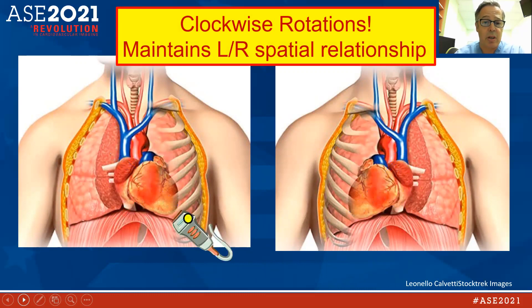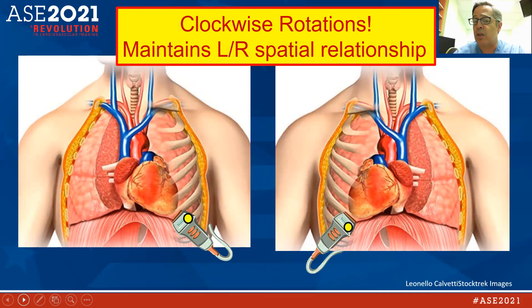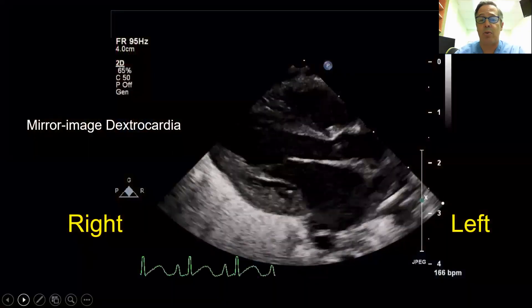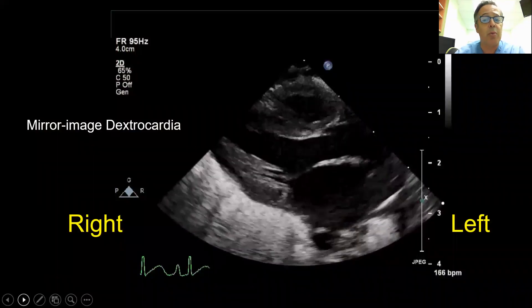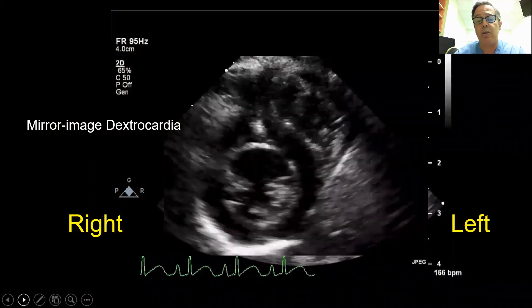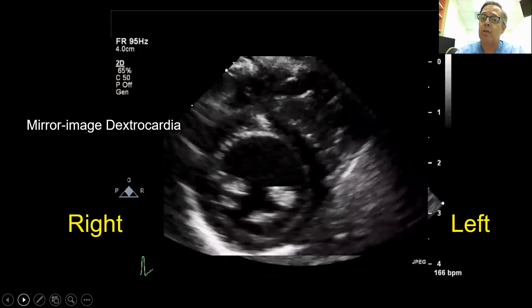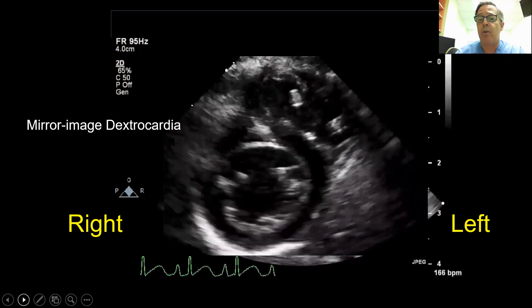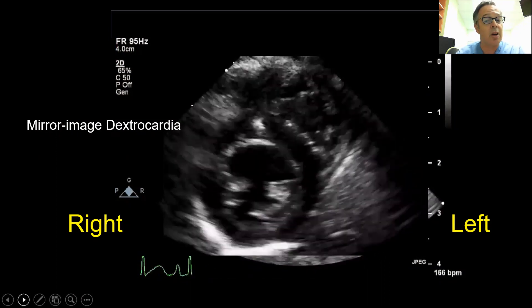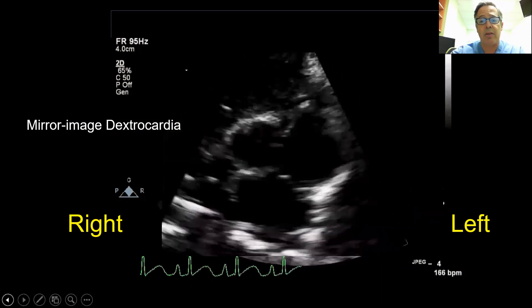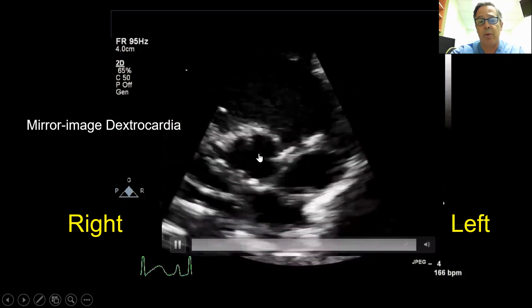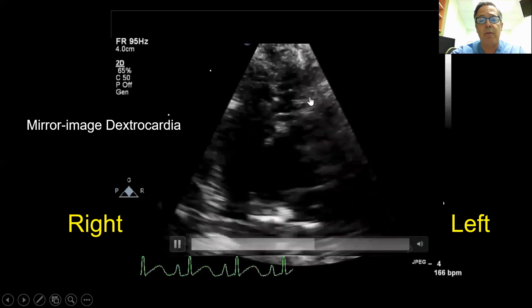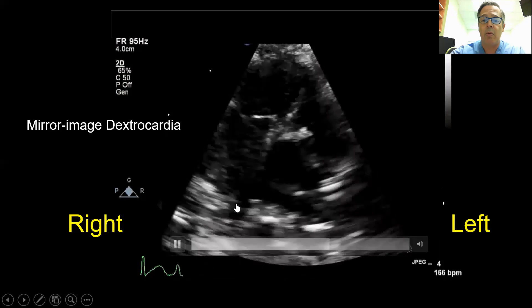For apical placement, for a levocardia heart it's the standard position at the point of maximal impulse with the marker pointed to the left. For dextrocardia, you simply move to the right apical position and keep the marker pointed to the left — very important. Here's the parasternal long axis view of a patient with mirror image dextrocardia, which looks like a normal typical parasternal long axis. After clockwise rotation, you see this is inverted ventricular arrangement with L-looped ventricles: right ventricle on the left, left ventricle on the right. You have the aortic valve at the base, the right atrium, left atrium, atrial septum, and sweeping more basal gives you the pulmonary valve and RVOT — opposite of what you'd see in a levocardia heart.